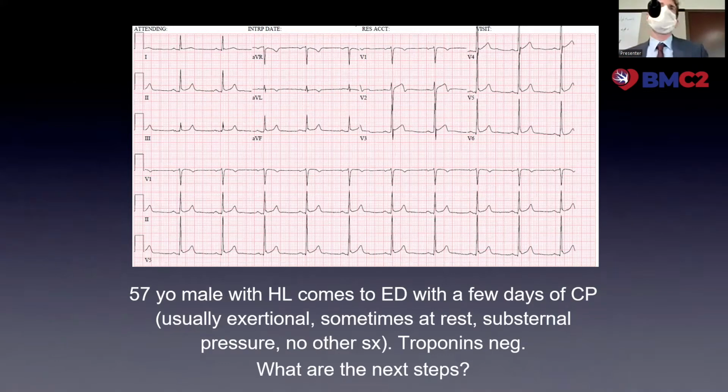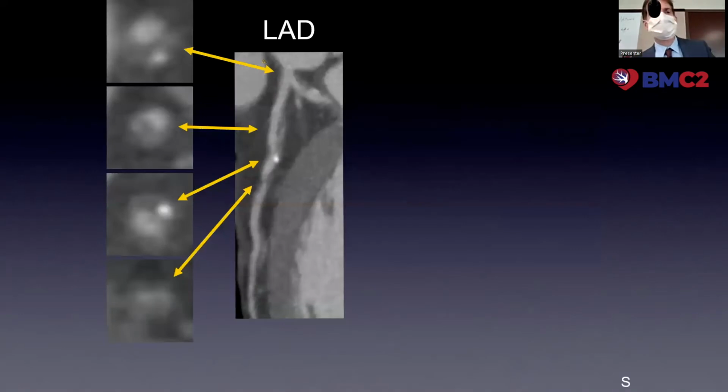Somebody coming to the emergency department with chest pain, further evaluation may be warranted. And we really have a lot of options. We have options of stress testing. We have options of coronary CT, which could be done as an inpatient or in the ED or as an outpatient. Sometimes just deciding that it's low likelihood and not doing testing is an option. I think in this case, most of us would consider testing. And this patient had a coronary CT scan.